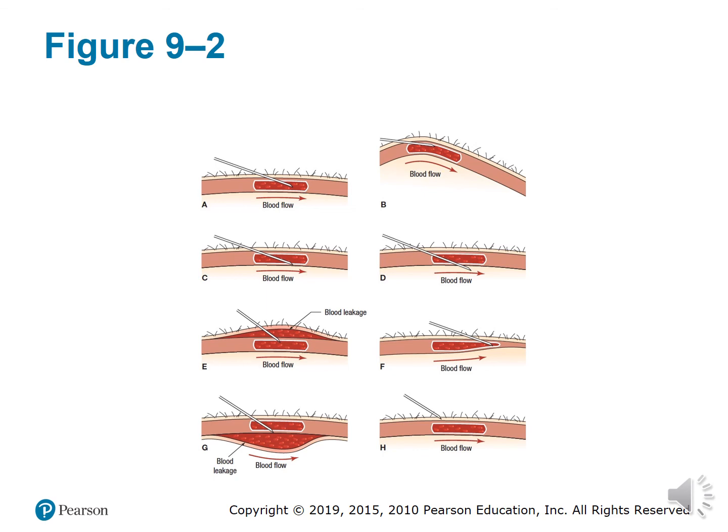If the needle goes through the vein, if you miss it, if the vein becomes constricted, this is why it's important. That's why we practice so much on this. I want to make sure that everyone is comfortable holding the needle, and has the steps down pat, knowing what it feels like. The difference between the skin, a needle, and not hitting the artery, because we definitely don't want to cause someone to have a hematoma or anything of that nature.